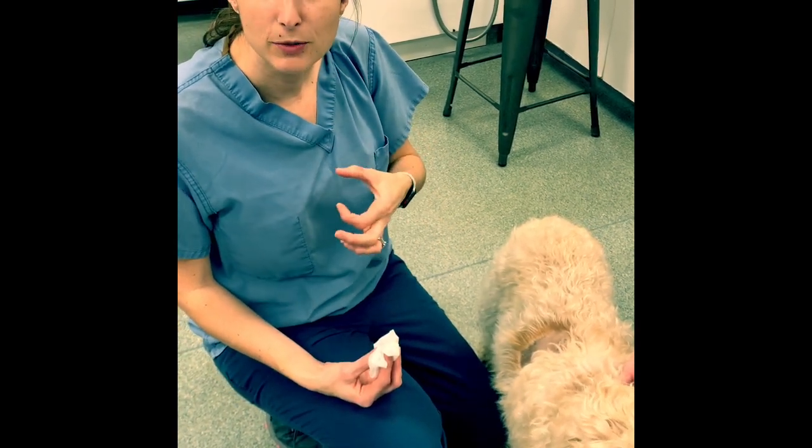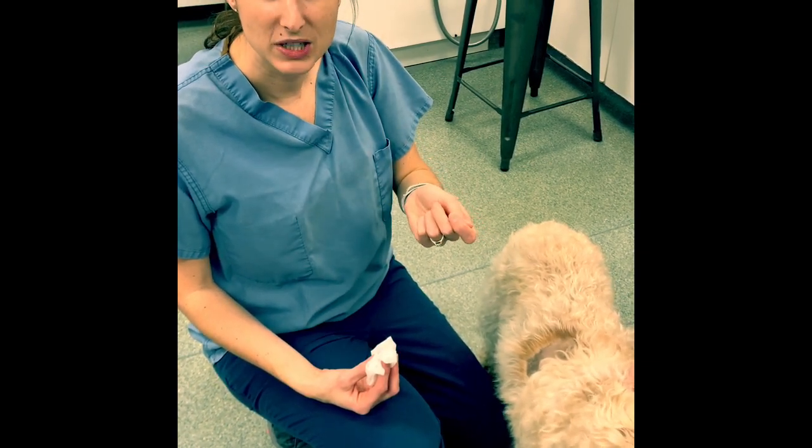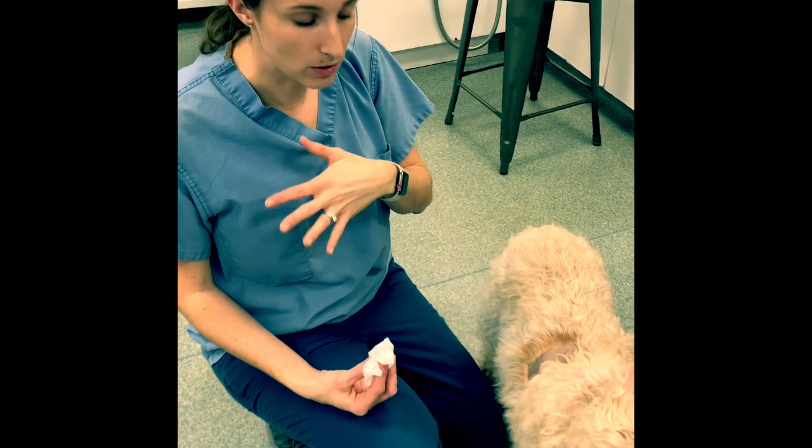They make these sensors for people that can go on the skin, and mom can scan it at home with her iPhone over 14 days, so we can get a lot of really good results.